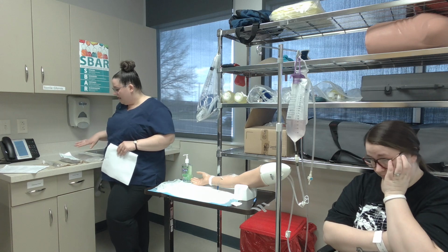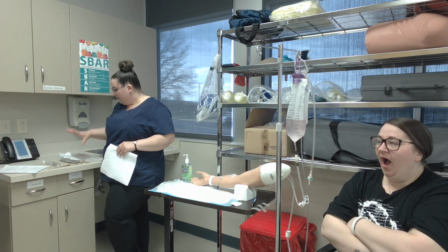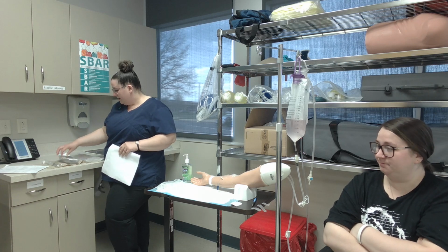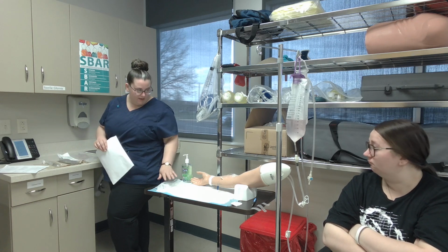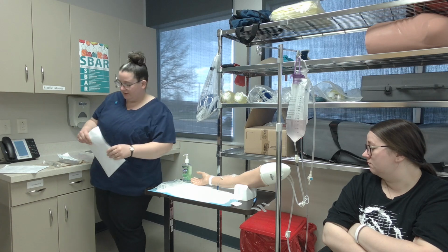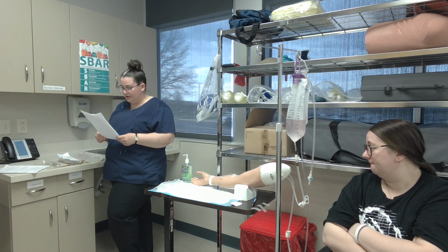I have gotten all my supplies ready. My IV flush, my bag of IV fluid, my tubing, and then I have my gloves and my alcohol wipes also. And my border for my medication.